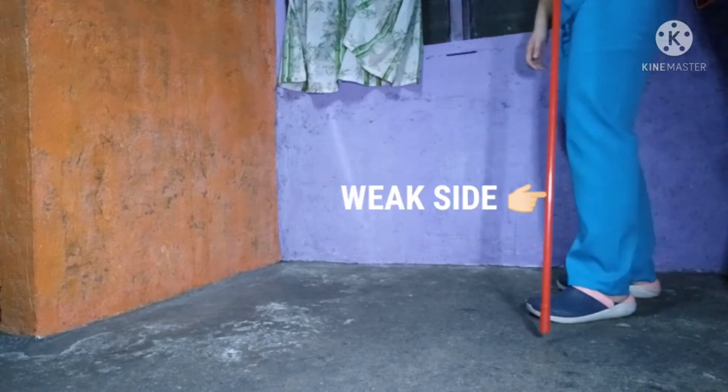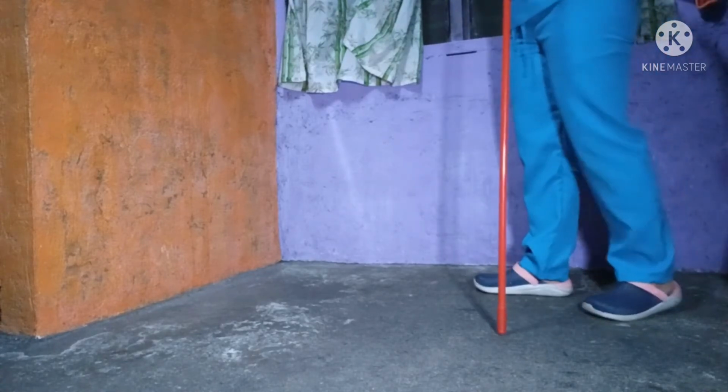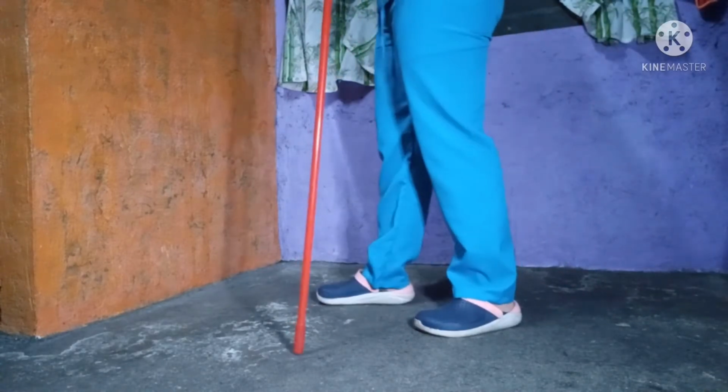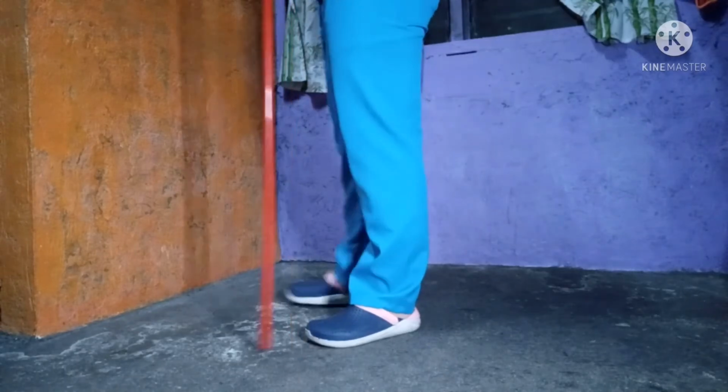To walk with the cane, the patient will hold the cane on the strong side, then the patient will move the cane and weak side together forward, and then move the strong side.